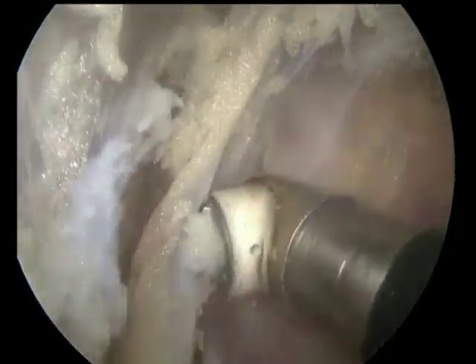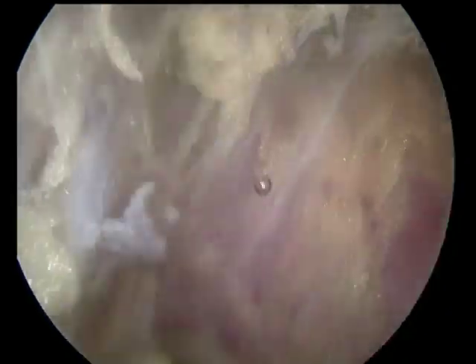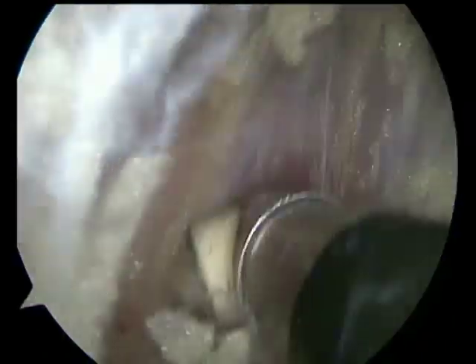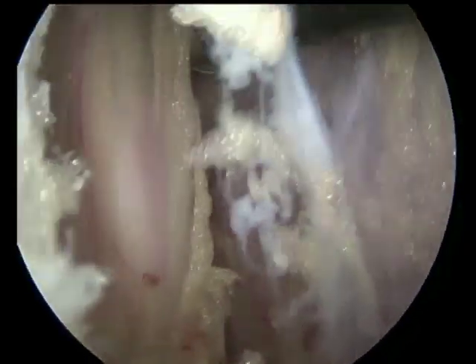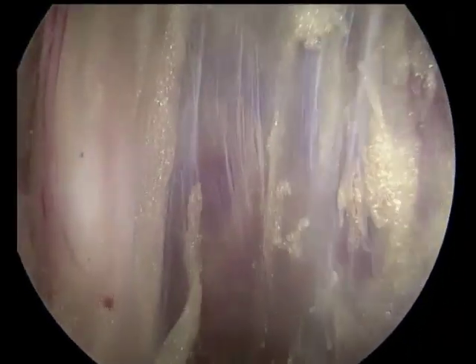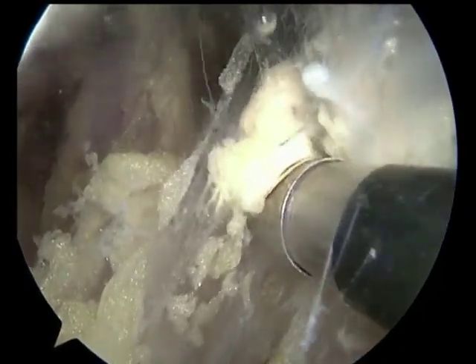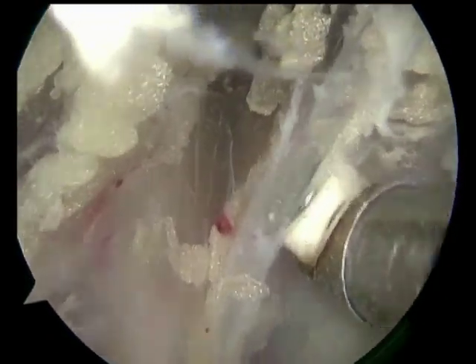Then we go to the lateral release. We cut all adhesions in this area with ablator, continue our release and approach to the sciatic nerve. After visualization of the sciatic nerve, we start performing release of the sciatic nerve and decompression in this area. And after release in this area, we start to prolong our release in proximal direction. This is more safety way to get approach to the infrapiriformis space, not to contact with vessels.